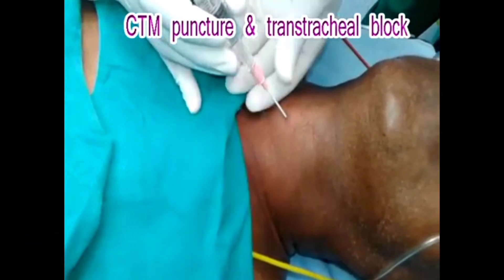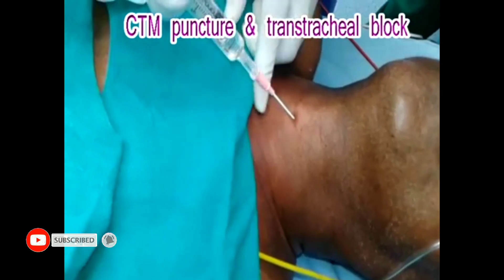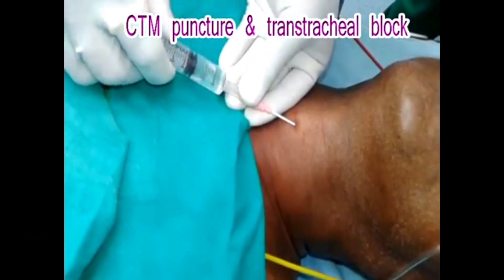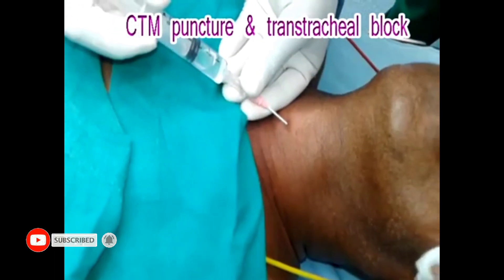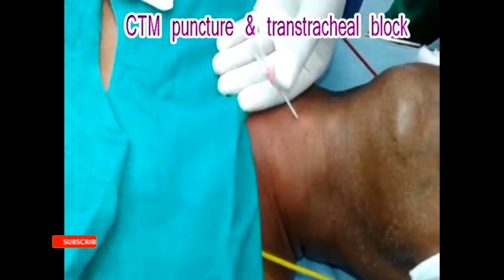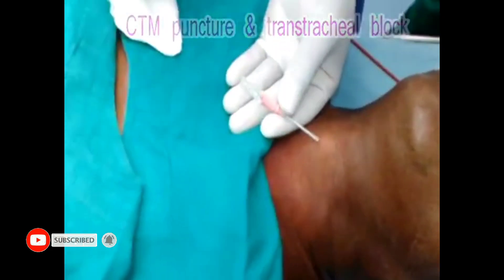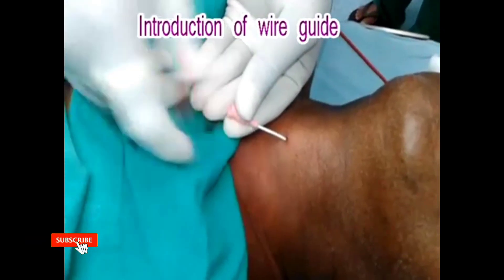Here, the cricothyroid membrane is punctured by using the introducer needle, and then the needle stilette is withdrawn after the position of the catheter has been confirmed by aspiration of air. At this point, 2 cc of 2% lignocaine solution is instilled during the patient's inspiration. The patient will get a reflex cough during expiration, and it also spreads the local anesthetic solution across the airway.